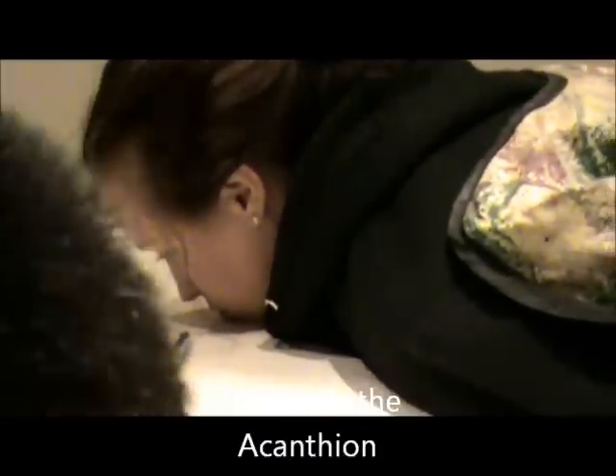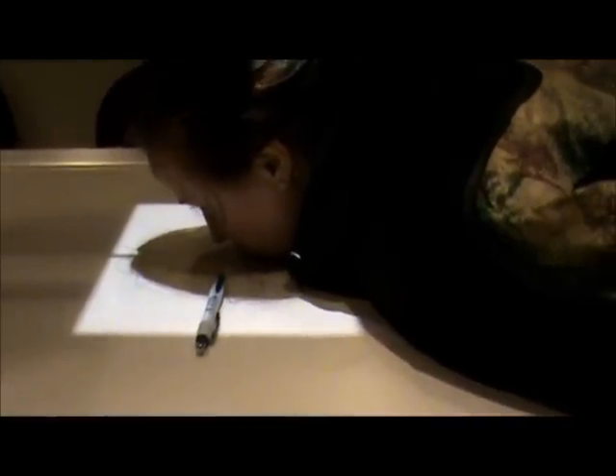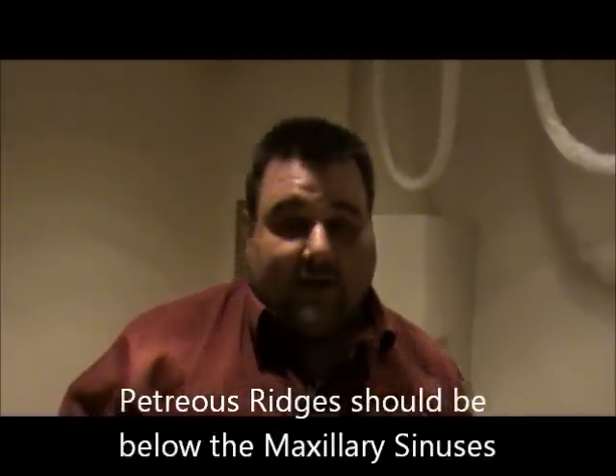I'm going to do my centering. The centering is going to exit at the Acantheon. I'm going to use my pen, mark my place, and open up my collimation. I want to move it so the line is on my pen and at the MSP. I'll take my pen out and collimate to the skin margins side to side and to the top of the head. I'm going to use my left marker. On this view, the petrous ridges should be below the maxillary sinuses — that's a good indication the positioning is correct. The technique will remain the same: 77 KV, center cell.